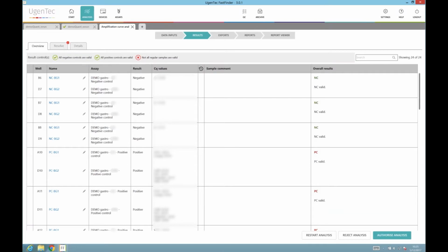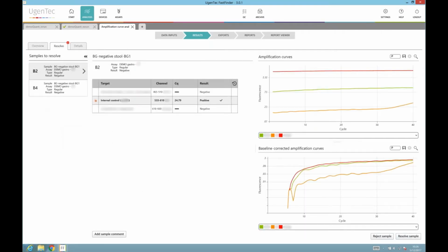For some results, you can see here I've got this red 2 above the Resolve tab. So as I was talking before about that some results have contentious outcomes, the algorithm has delivered an interpretation that's not in the degree of confidence that we would like in the outcome.